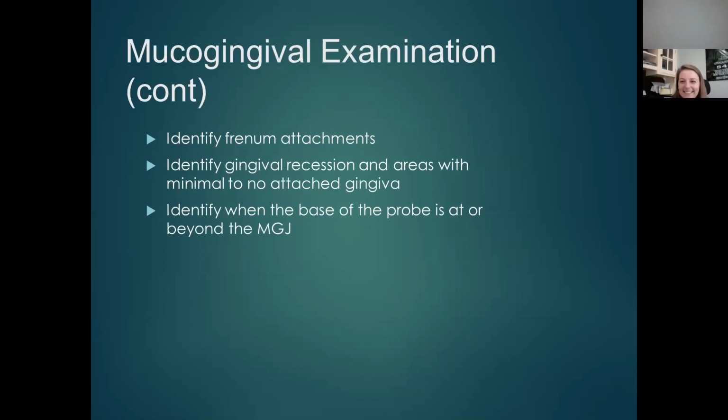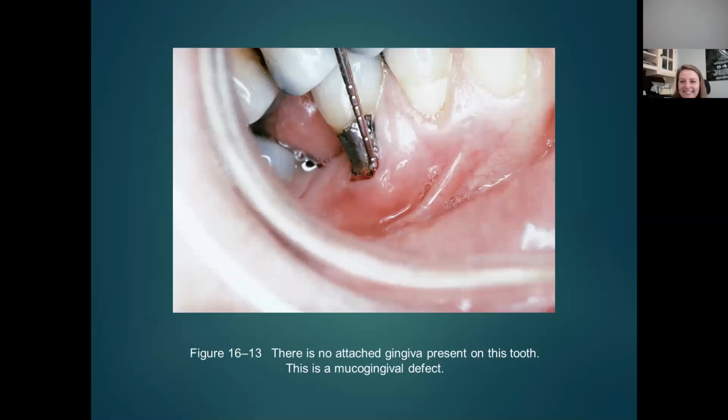The nice thing about the physiologically pigmented gingiva is that you can see the demarcation lines. But some people have thin red mucosa and very vascular attached gingiva, which can often look just like the free gingiva as well as the attached gingiva and the buccal mucosa. You can't demarcate things, so we need to be identifying that with the periodontal probe.